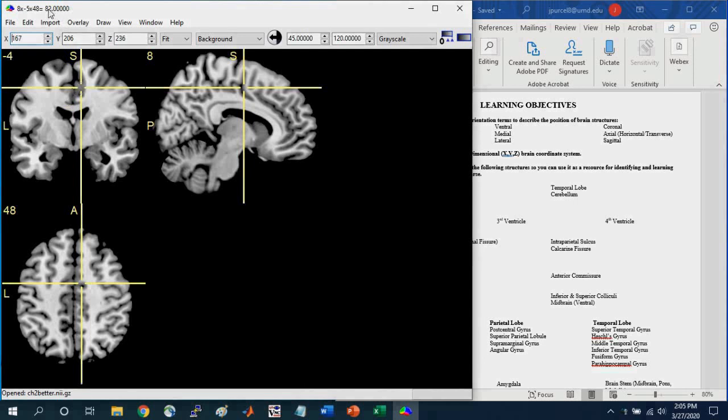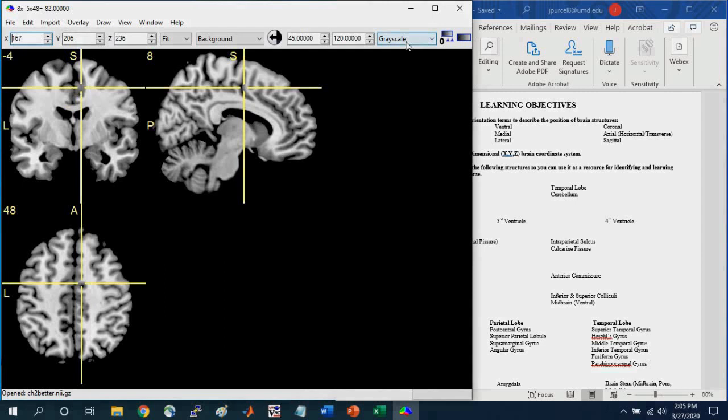And so these intensity values really are just numbers that we're assigning an arbitrary color to. So we're using the grayscale to assign these colors to these specific numbers.